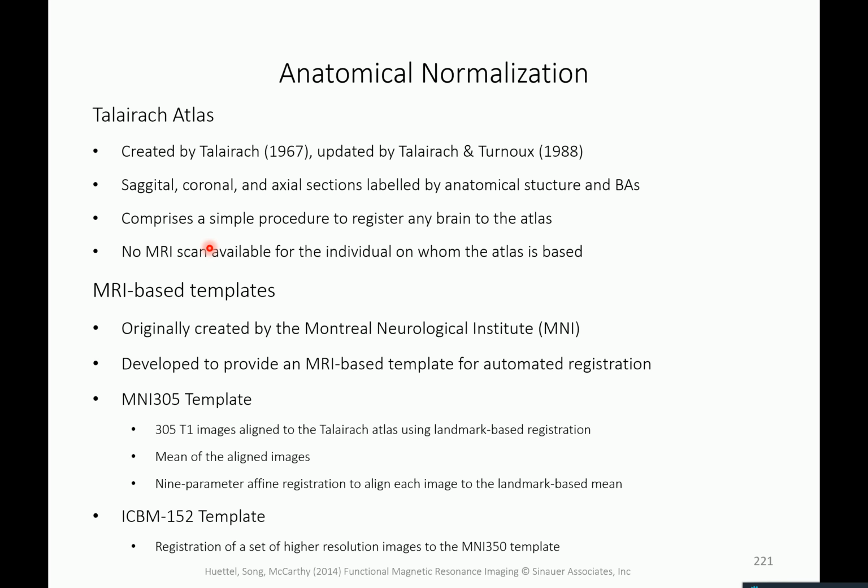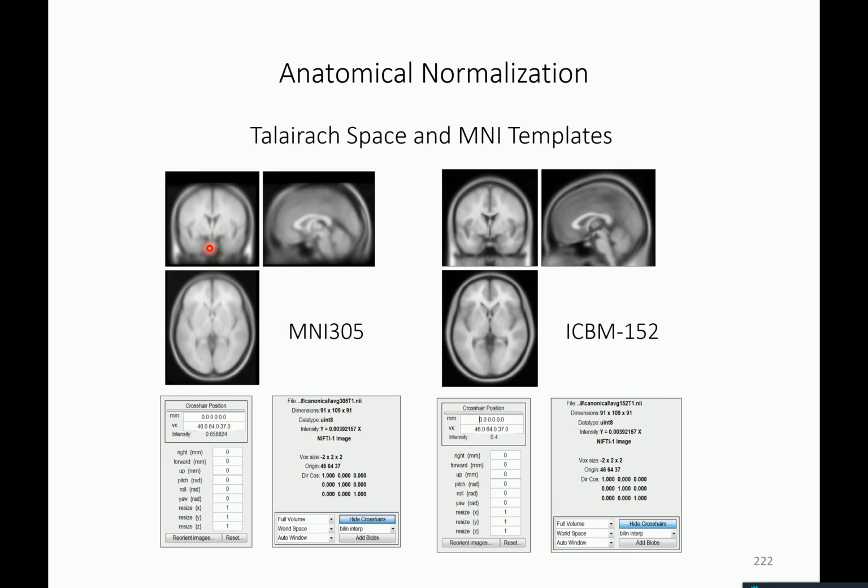And there's another template, the ICBM 152 template, which is a higher resolution than the MNI 305. So this shows actually the images.